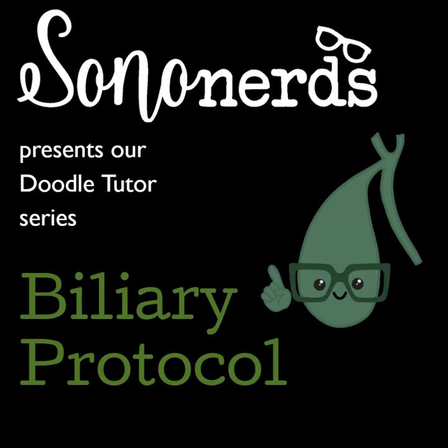Welcome to Sononerds Doodle Tutor series. This video will walk you through the basic ultrasound protocol of the gallbladder and biliary tree. We will take a look at ultrasound images, draw diagrams together, label them, and cover some tips to help with imaging the gallbladder by ultrasound.